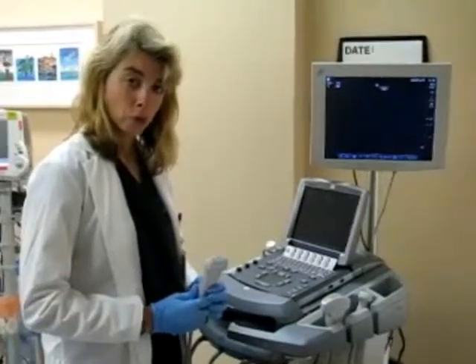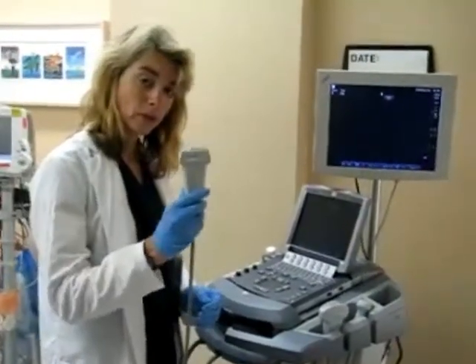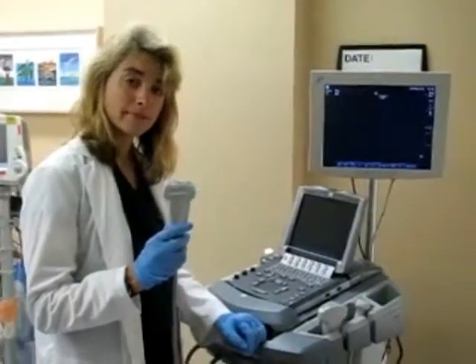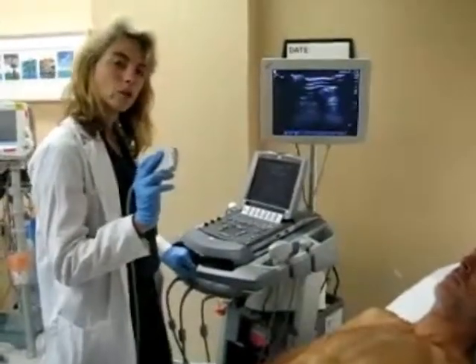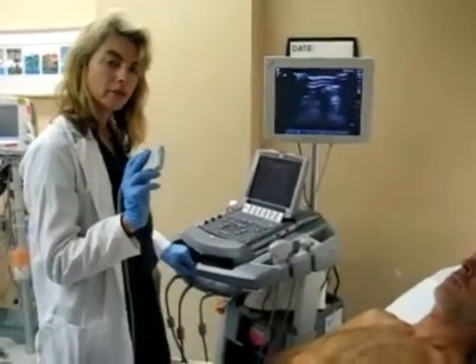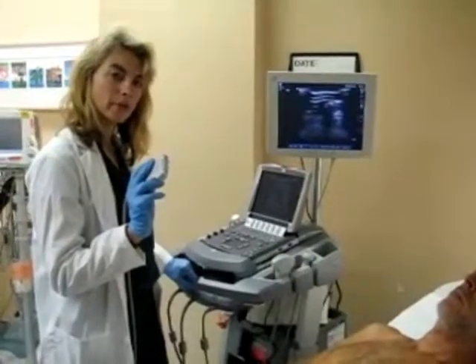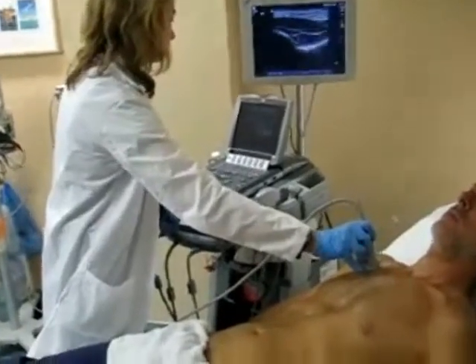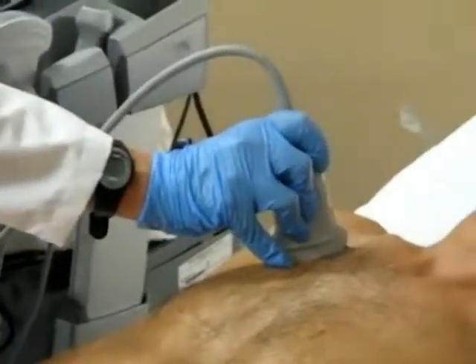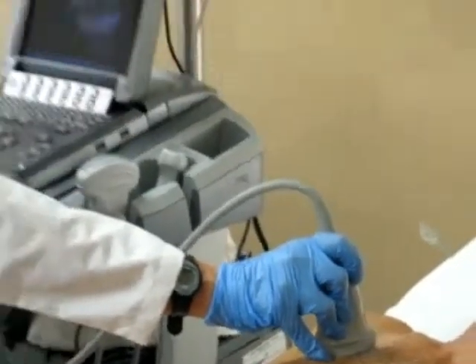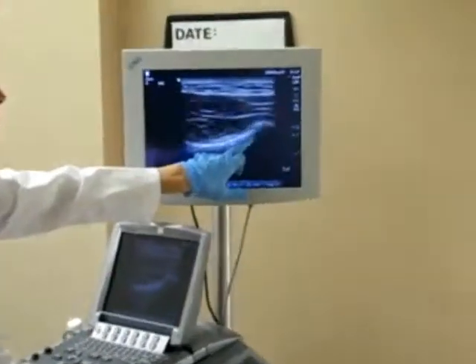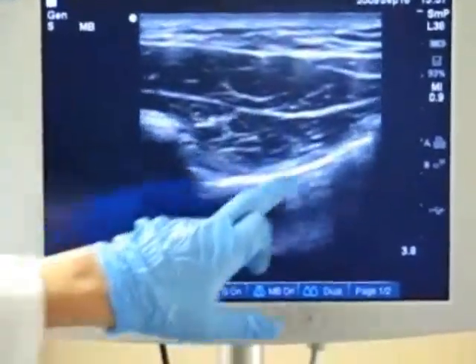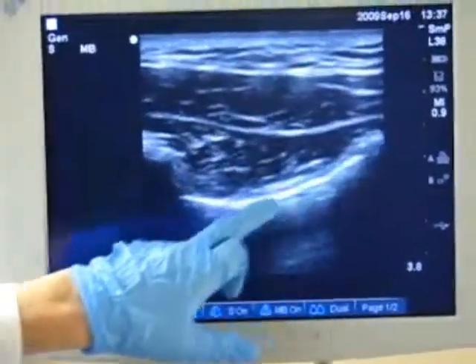In E-FAST, one has to change the probe type to that of the linear probe, which is the same type of probe we use for invasive procedures such as IJ central lines. With a low level of suspicion for pneumothorax, a quick evaluation can be done by taking the linear probe, placing it just below the clavicle, and moving it so that you have a rib — shown here by a dark space — caused by the sound wave not being able to penetrate through the rib, to the area in between the ribs, which is the pleural line.